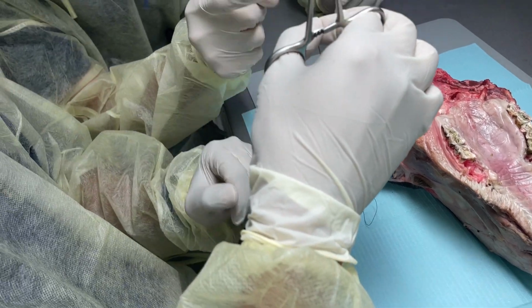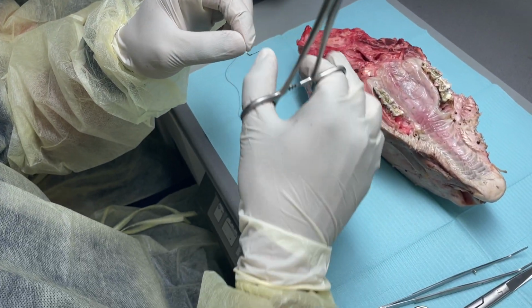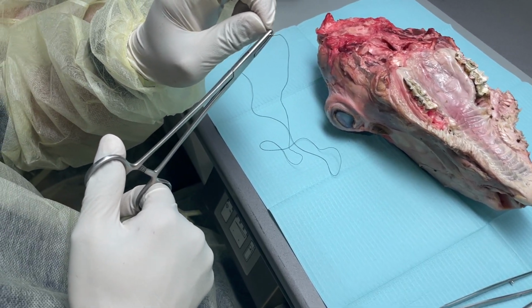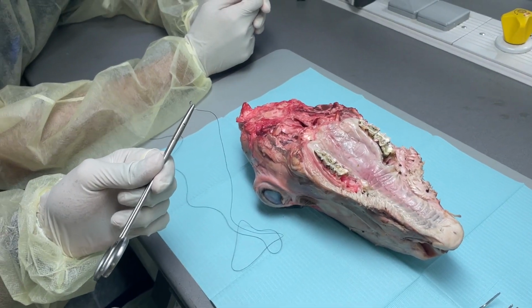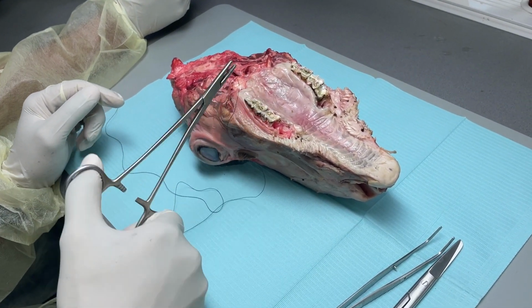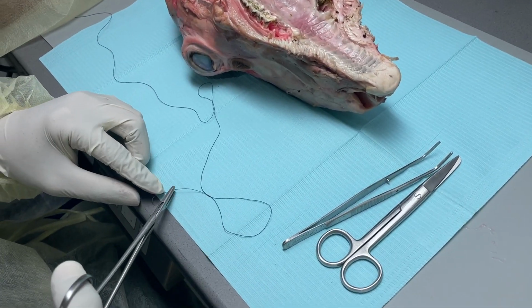Here it should be 2/3 or 1/3 will be enough. 3/4 from the point. Okay, so that is somewhere here, in the middle. Correct? And I locked it. Why did I lock? Because if I don't lock, when I am pushing through, it will close like this. So I will lock it.